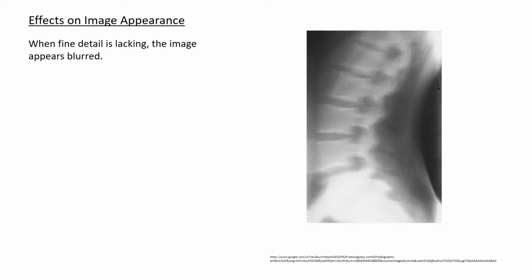The effects on image appearance. When fine detail is lacking, the image appears very blurry looking. And blurry images are not conducive to a good diagnosis. The radiologist is not going to be able to make a good diagnosis if he or she is looking at a blurry image.